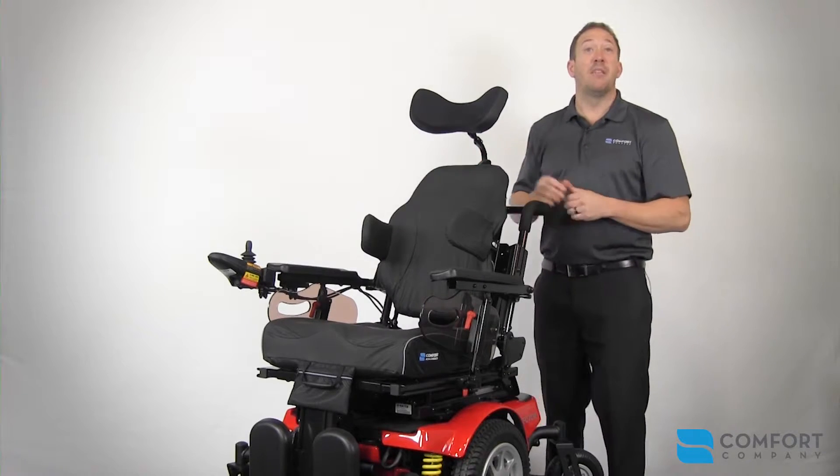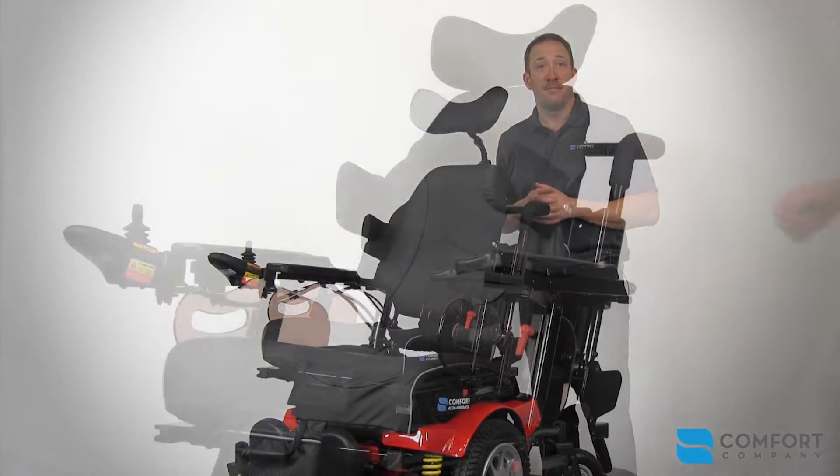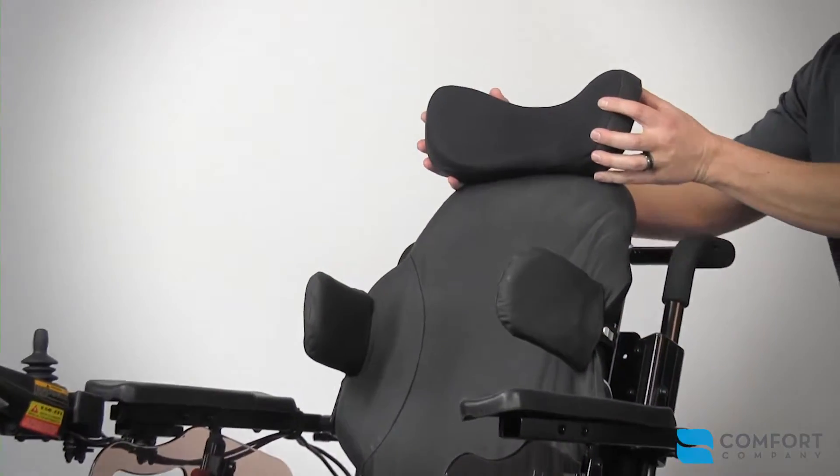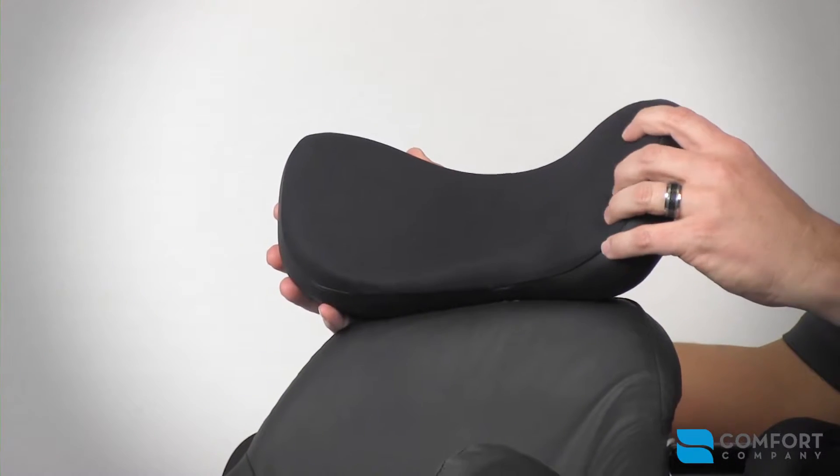Now that we have the back installed, let's cover a few of the key features of your sample seating system. The BodyLink head support system comes in five sizes, three cover selections, and two foam densities.